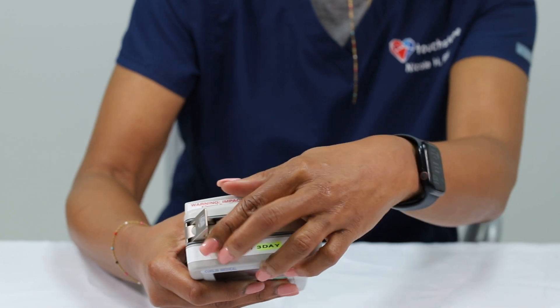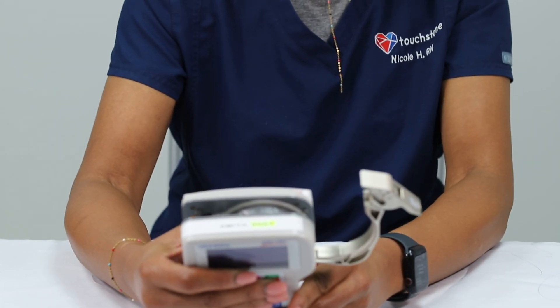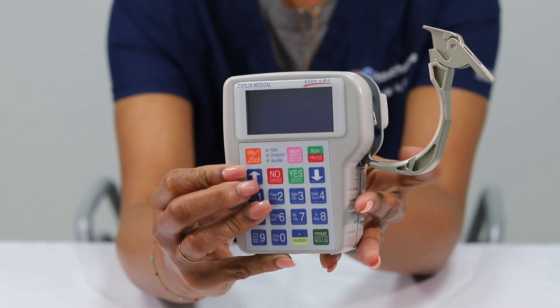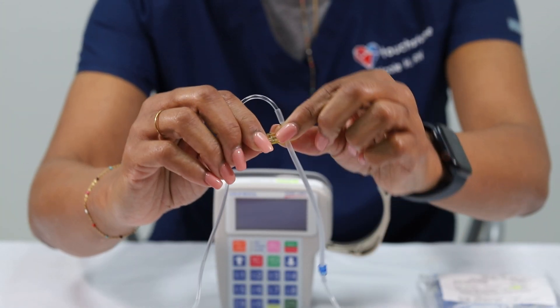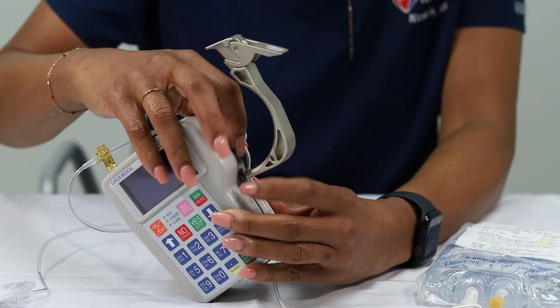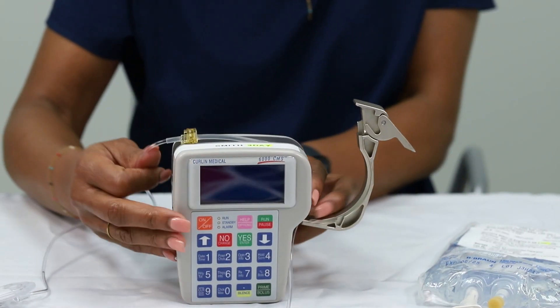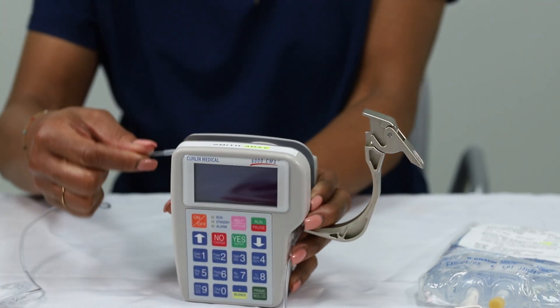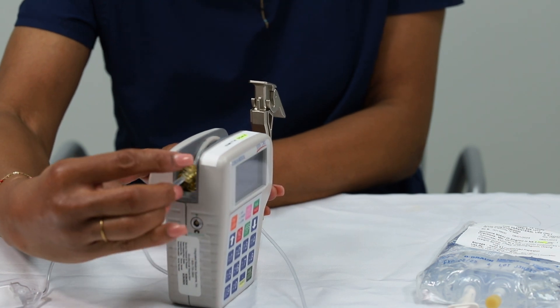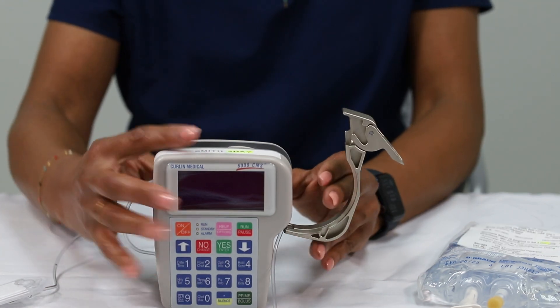To load the tubing into your Curlin pump, lift the lever on top of the pump labeled 'lift to open,' then pull the lever outwards. Locate the blue and yellow arrows on either side of the pump. Twist and pull the yellow tab from the yellow cartridge on the IV tubing. Insert the blue plastic piece into the square opening next to the blue arrow. Move the tubing along the soft gray top of the pump while using your finger to hold the blue plastic in place. Next, insert the yellow cartridge into the square space below the yellow arrow.